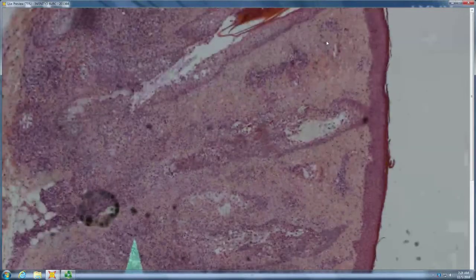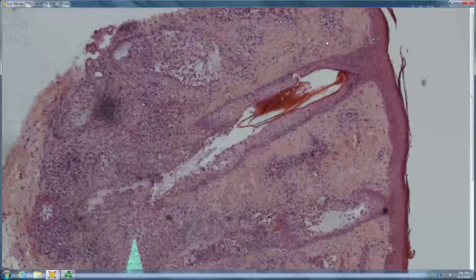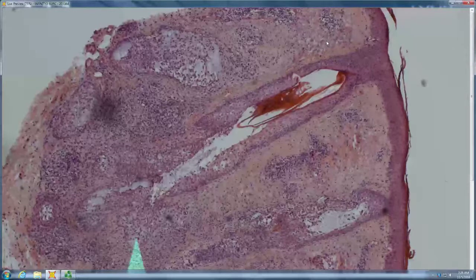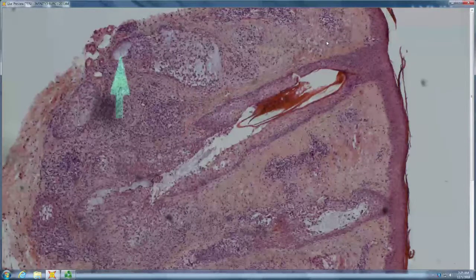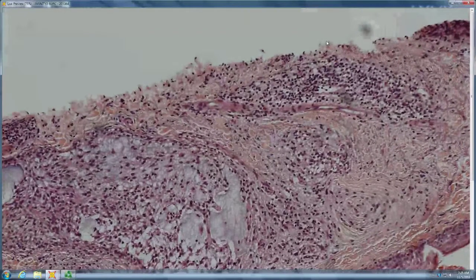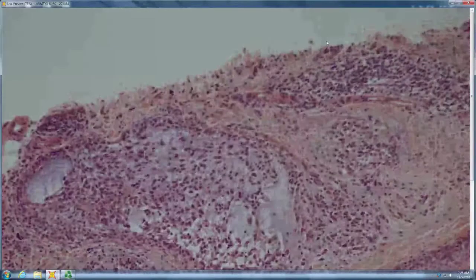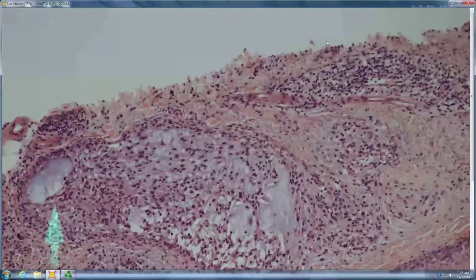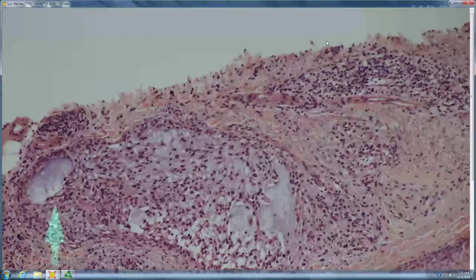Okay, how about this one? I see a punch biopsy with inflammation kind of along the hair follicle and deep. Yeah, so inflammation's kind of everywhere, maybe heavier deep than superficial, but kind of everywhere. And then anything going on in the follicle? I see mucin right there, and so alopecia mucinosa. Yeah, and sometimes there's associated follicular mucinosis, and then what you're alluding to is follicular mucinosis comes in two flavors, with or without mycosis fungoides.